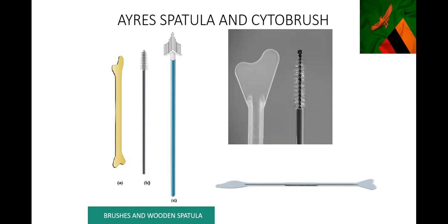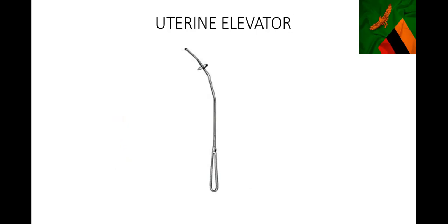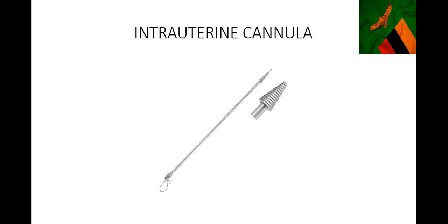This is a uterine elevator - an instrument you put in the uterus to manipulate it. Sometimes when doing a bilateral tubal ligation with a small incision, it's difficult to find the uterus. If you put this in the cervix vaginally, somebody can manipulate the uterus from below to make access easier for the surgeon. This is an intrauterine cannula, commonly used when doing an HSG - hysterosalpingogram. You insert it and screw it into the cervix, inject contrast through it, then take X-ray pictures to get your hysterosalpingogram.